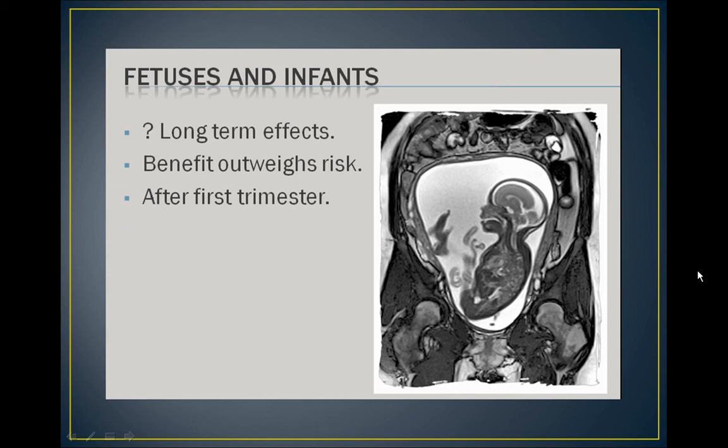If it is deemed a medical necessity that the expectant mother have an MRI by both her referring physician and the radiologist from your institution, it is also helpful to wait until you're at least past the first trimester. This may limit any ill effects that could be caused during the most crucial time of fetal development. This policy may change by facility, but it is important to understand the department protocol and check with a radiologist before scanning any pregnant person.